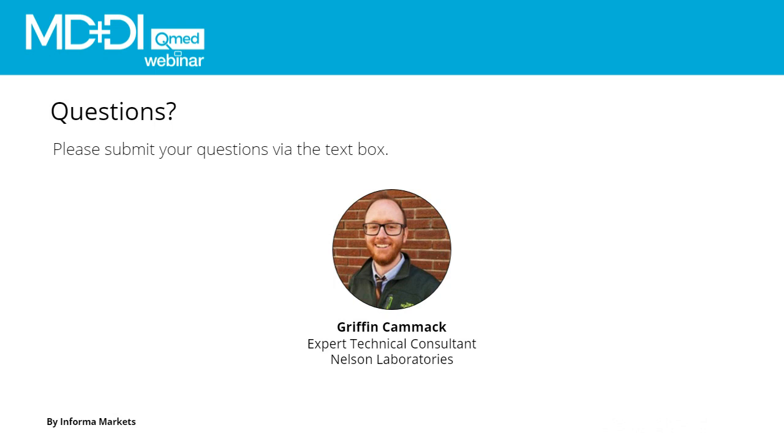Yeah, that is a great question. I would say, if you're following the strict Spalding classification, that is technically a non-patient contacting device. However, as which it'll be a non-critical device, right? However, with its use with the retractor and where it's being used, we often just tend to treat those as critical devices, and then additionally, a lot of those devices are often packaged in sterilization trays with those critical devices, so they're all treated as the same.